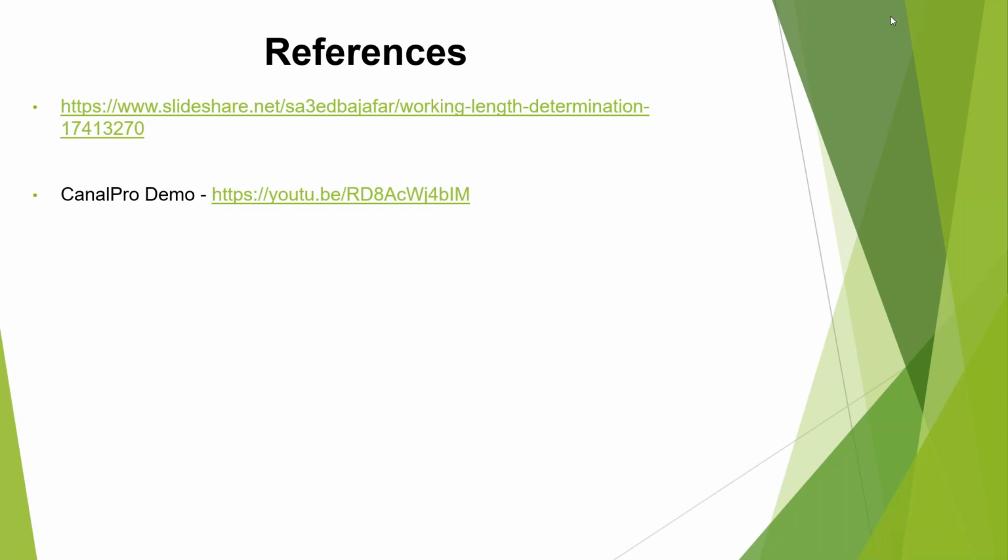However, if it's overly saturated, filled to the brim, flooded, it's not going to be as accurate. I mean, none of them are really going to work that well in a flooded situation, even ours.